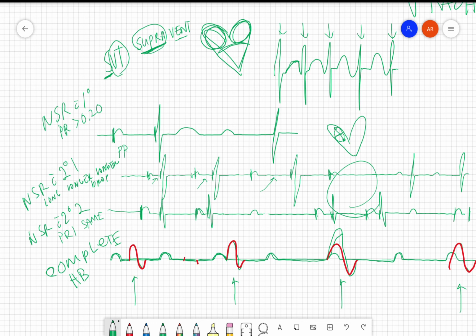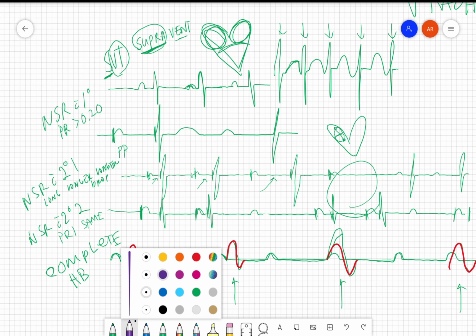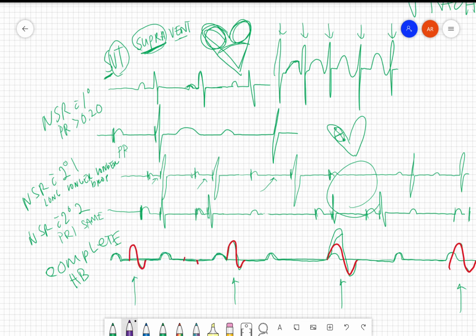The way that I like to think about this is, if we have a husband and wife, newly married, and everything's going great, and they are in a sinus rhythm. They're working well together. Atria is the wife, by the way. So let me get a pretty wife color. Purple. Is that a wife color? I don't know. Okay, so we've got the P wave.